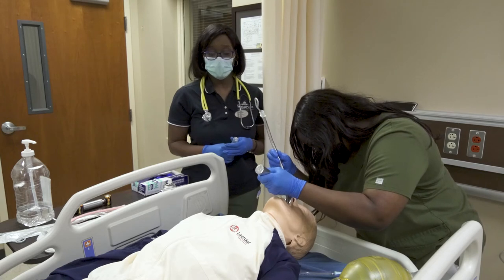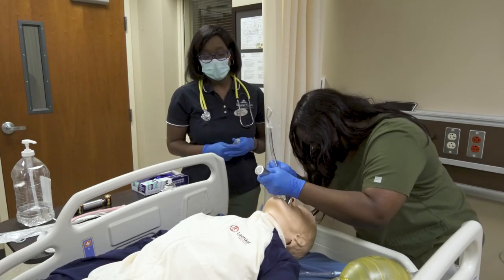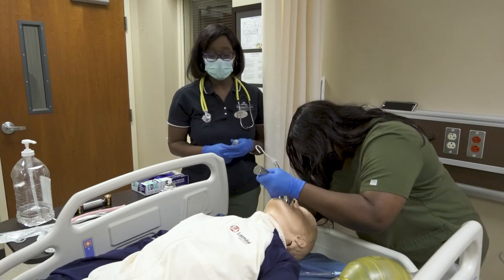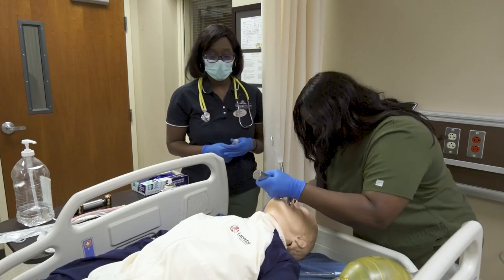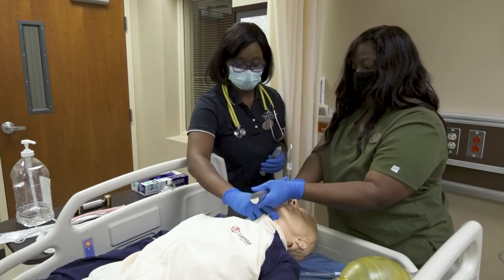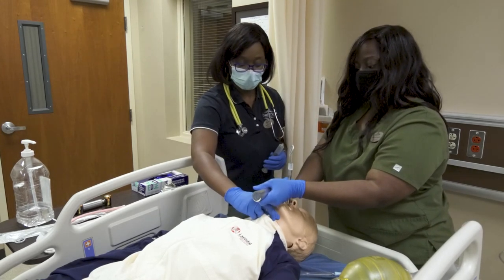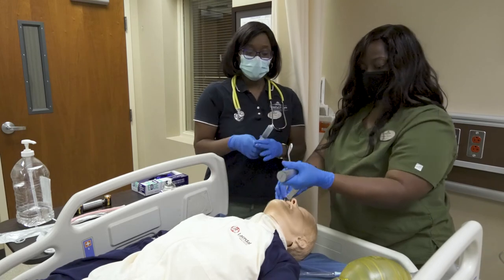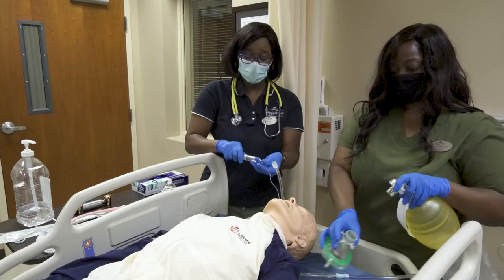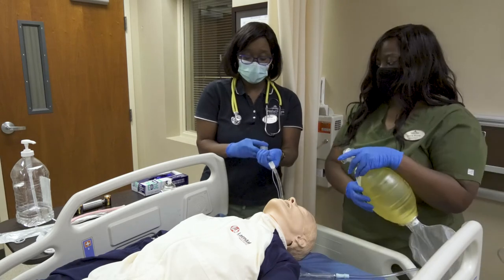Insert the ET tube, visualizing the vocal cords. If needed, add cricoid pressure. Remove the stylet and inflate the ET tube cuff.